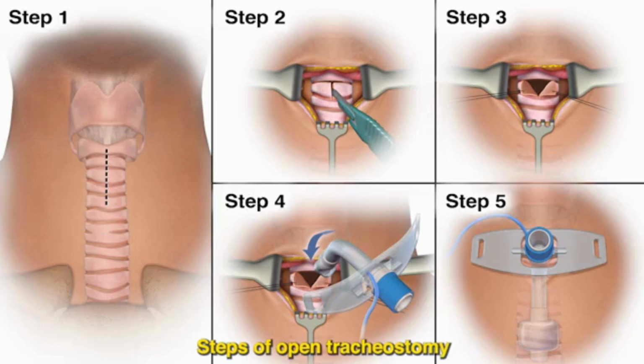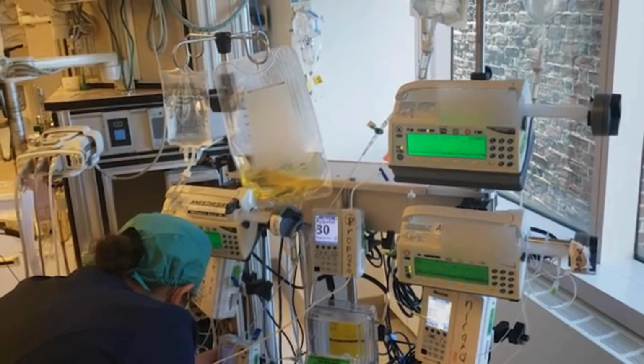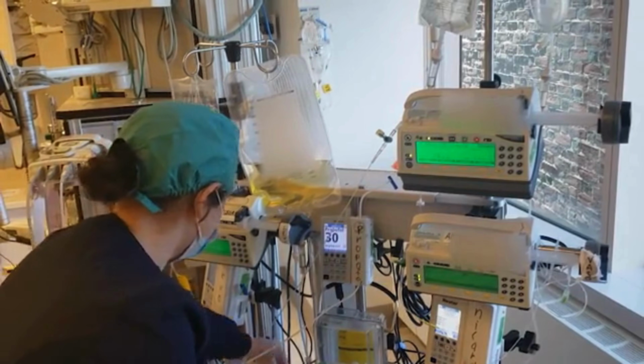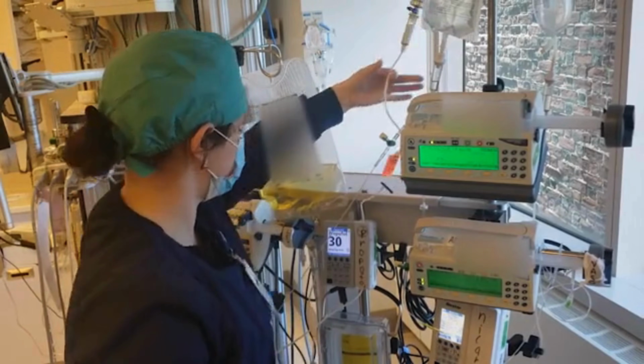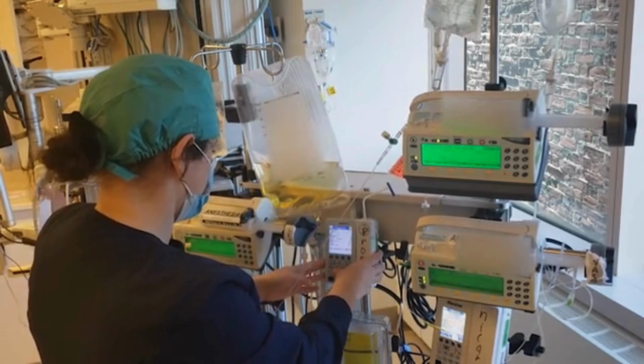Before starting, conduct a pre-procedure timeout to verify patient identity and procedure. After the timeout, have the nurse administer a short-acting paralytic and, if needed, additional sedation. Inadequate paralysis risks inadvertent extubation during oral endotracheal tube manipulation. The nurse should then leave the room to minimize exposure but remain available.